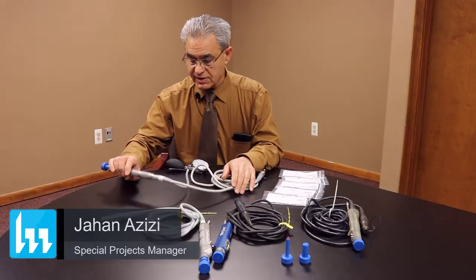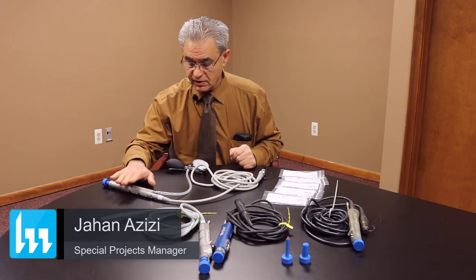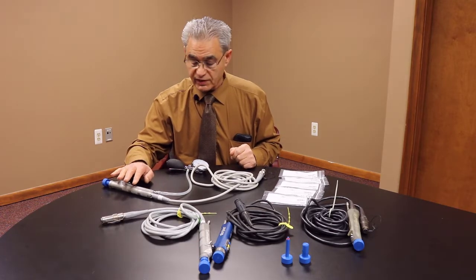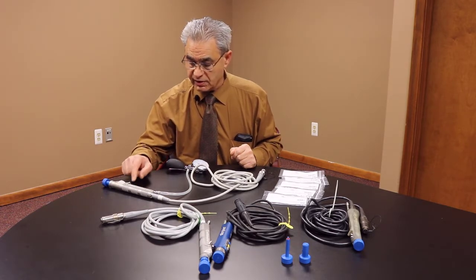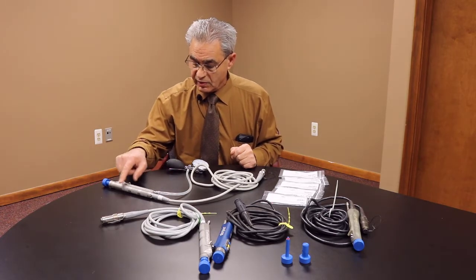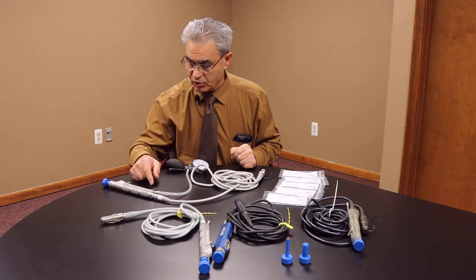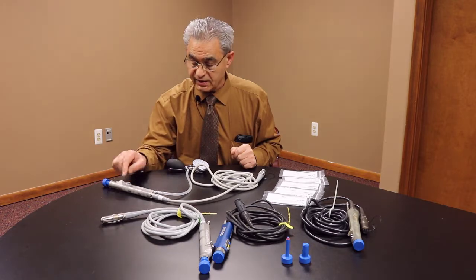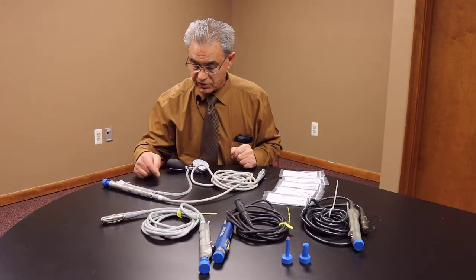Hello, this is Johan Azizi. What we are going to talk about today is the issue that some arthroscopic shavers have. One of the ones that came to our attention is the O-rings that are inside this area that block the fluid from going to the electronic portion. There is potential for wearing and leaking — so the potential for fluid leak going from this area to the electronics.